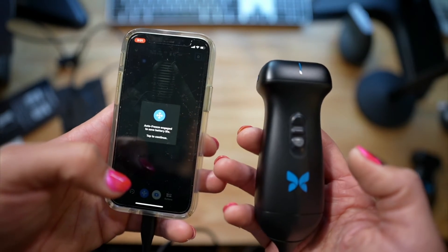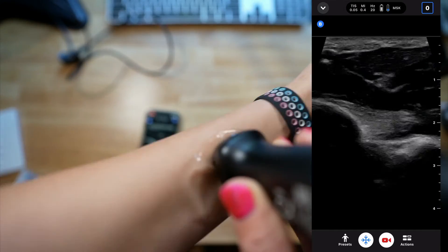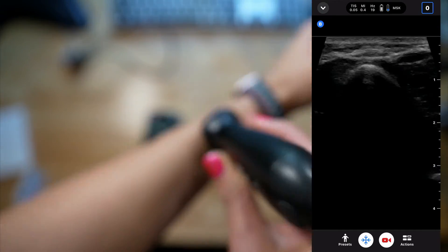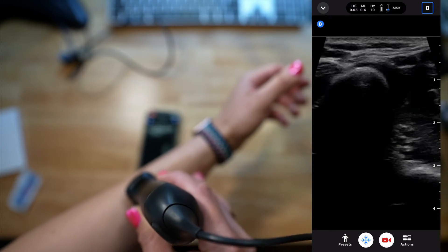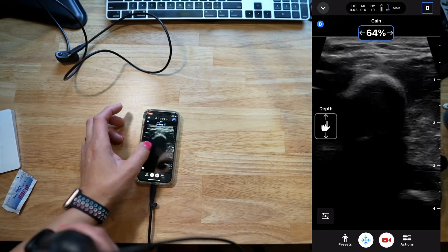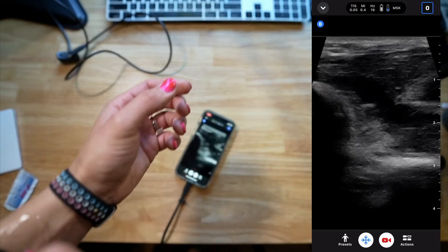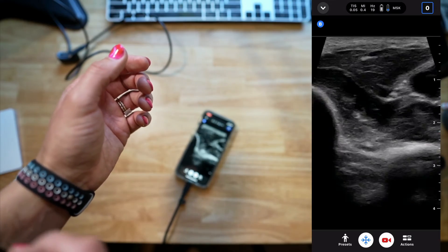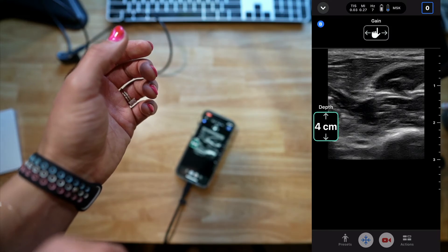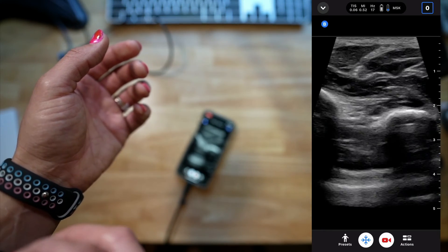Let me find some gel and just see what a few structures on me look like. We're going to do a little scanning on my arm here. It's not bad — the resolution is pretty good. I'm going to increase the gain just a bit, and then let's practice with the buttons. Oh, that worked pretty good. I like that. The image quality is great.